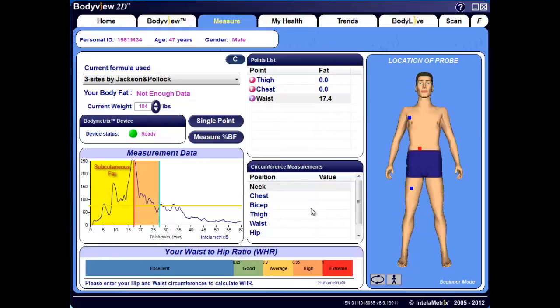Subcutaneous fat in the abdomen can then be broken down into two compartments or layers. Superficial adipose tissue, or SAT, is the first layer from 0 millimeters to this first strong peak at approximately 9 millimeters. This peak actually represents a thin layer of connective tissue known as a fascia, separating the superficial and deep adipose tissue layers. The deep adipose tissue, or DAT, is a layer between the fascia and the actual fat muscle interface here at 17.4 millimeters.